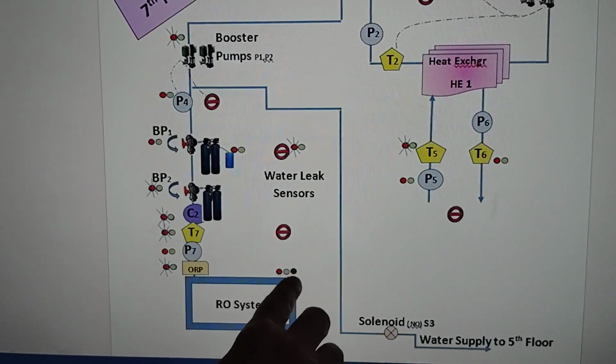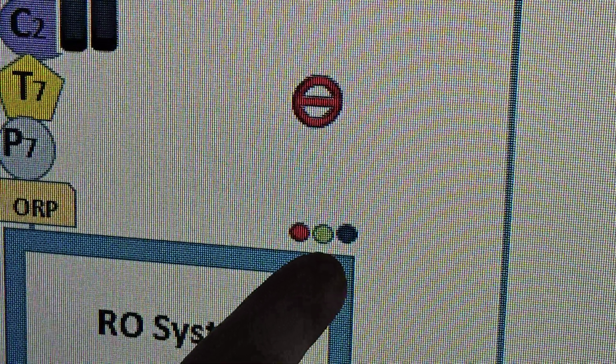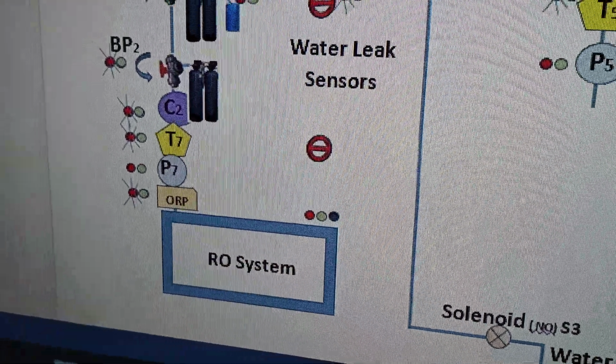The RO system will also be indicated with 3 indications. If it is blue, then the RO is working, it's on. If it is green, then the RO is in the standby position. If it is red, then the RO is in a disinfection mode.